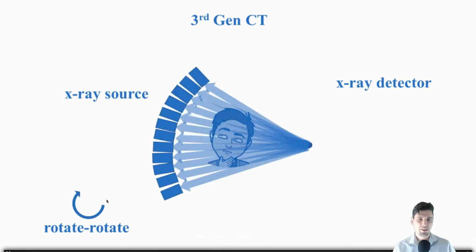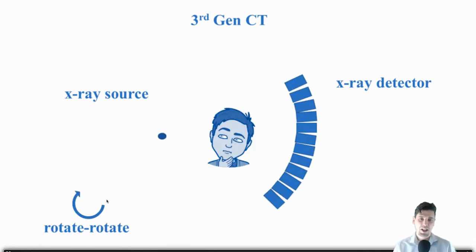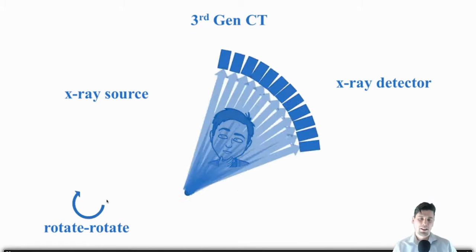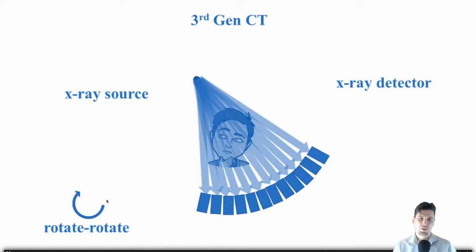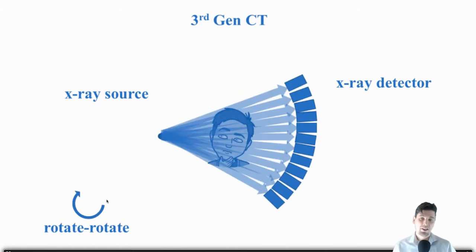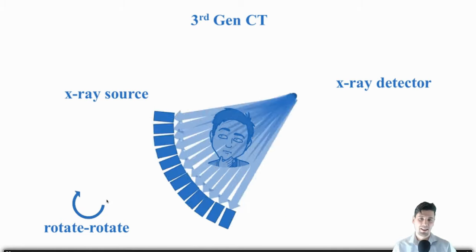Some people also have given names to subsequent scanning geometries, like when the table moves, give that another generation name. But in my opinion, this third generation CT is really the one that is the base of all of modern CT scanning.